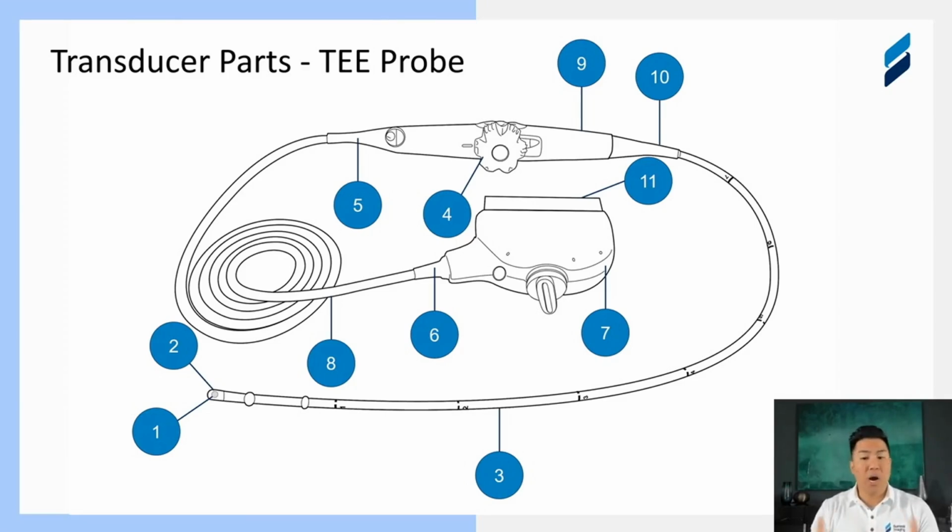And then they get washed by whatever technician is taking care of that at your facility. They're literally getting washed. Water and electronics don't mix, and the electronics always loses that battle. So really pay attention to how these are being cared for, transported, and used, and inspect these transducers after every study to see if there's any potential damage. If you catch it early, it can result in a relatively small repair cost relative to a full replacement of this specialized device.